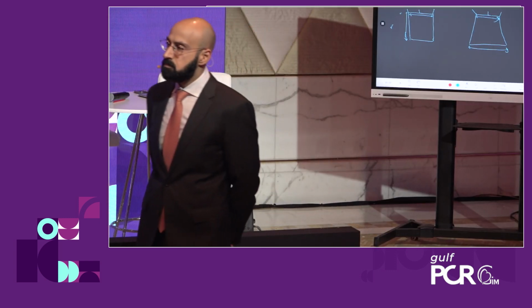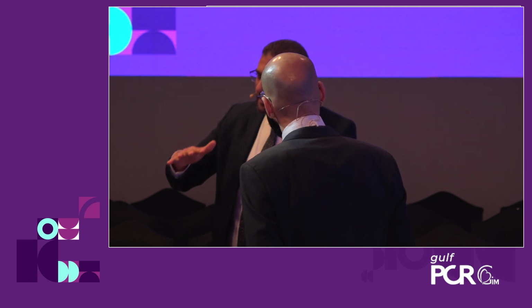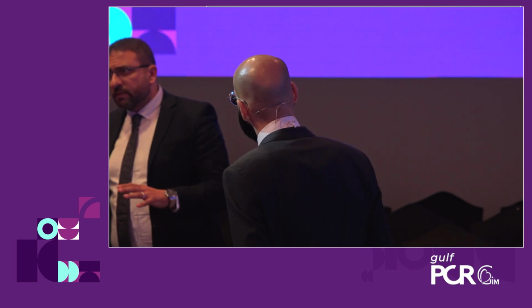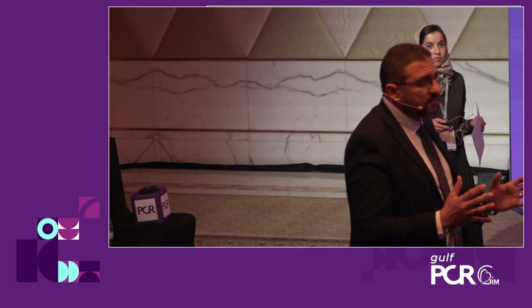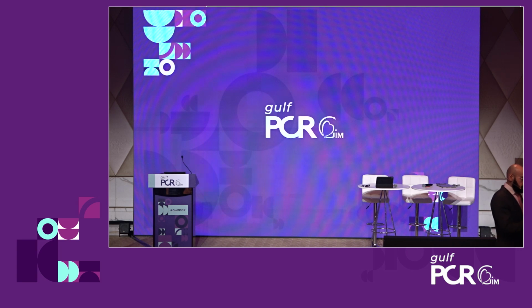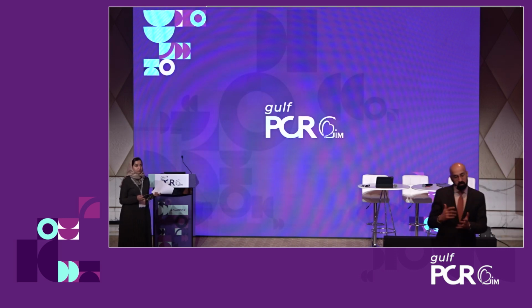Okay, when you have a discrepancy between the annular size and the LVOT size, you have to assess the whole anatomy, because sometimes you have a perimeter-derived diameter that lies in the gray zone between two valve sizes. So if you have a spacious LVOT, usually we oversize the valve. If we have a small LVOT, usually we stick to the smaller size valve. And the risk of embolization is really low because with the final step, which is very fast, the valve anchors and the risk of pop-up is minimal actually. In fact, it's probably advantageous to use it in those kind of anatomies, because with the other valves, if you have a very small LVOT, you risk a pacemaker and oversizing will be very high at that location.